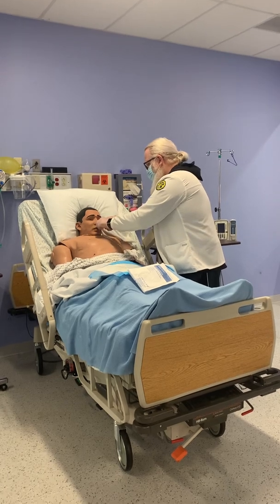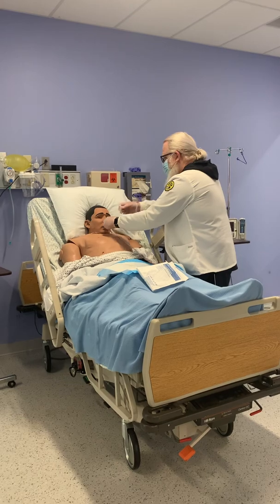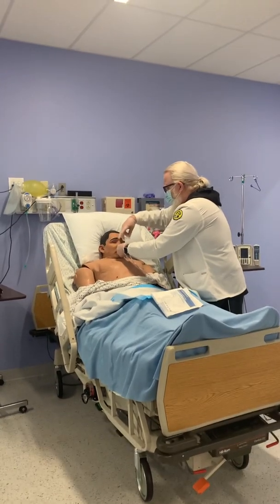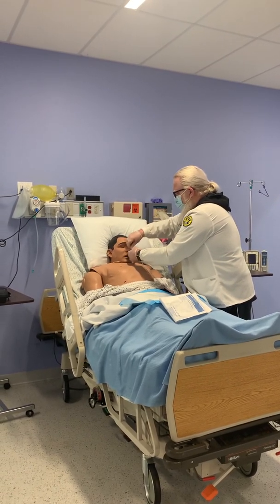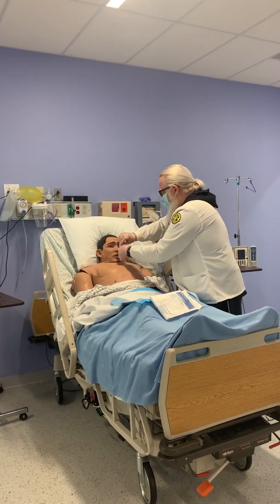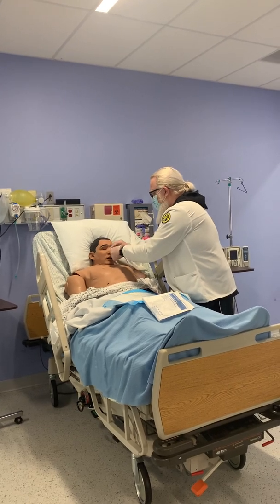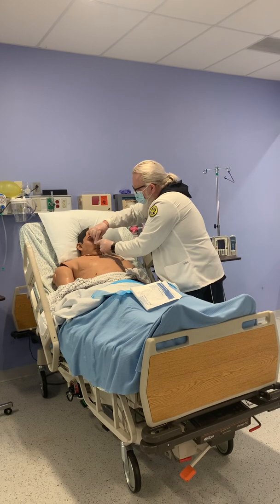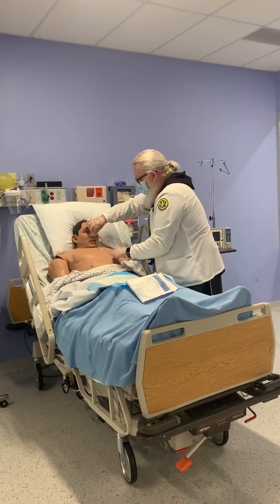It's in place. So what I'm going to do now is tape it in place so that we're not going to get any more movement, while holding it here. You doing okay? You tolerated that well. The worst of it is over. Take that in place there. There you go. Okay, good.